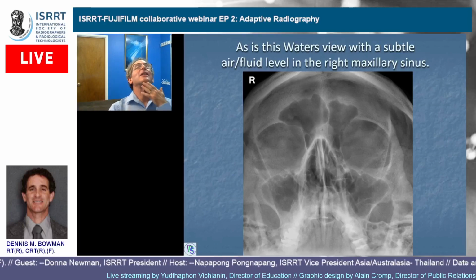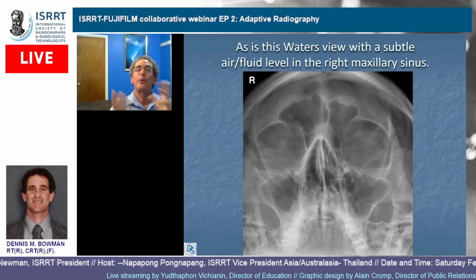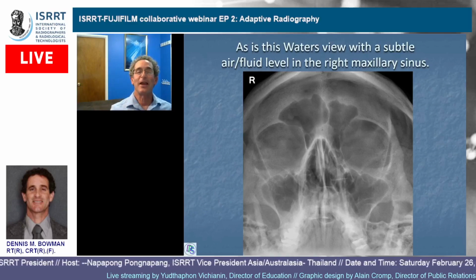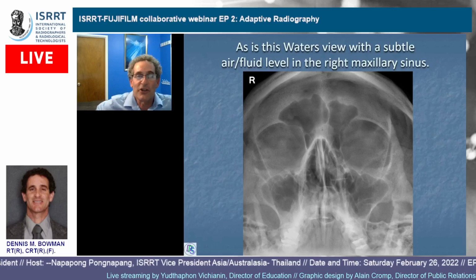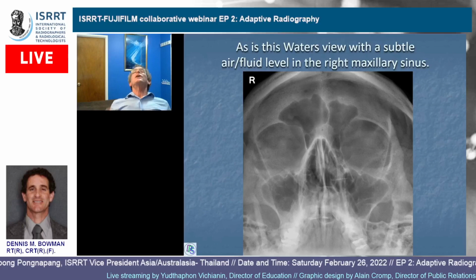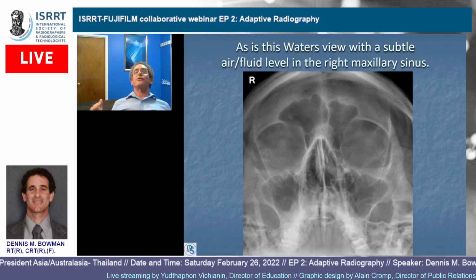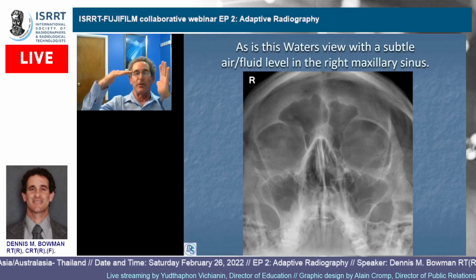So what's the trick? Let's say they really can't lift their chin up, and you don't want to angle your tube. Well, the trick is turn them around AP, and then in the chair, make sure it's a chair that's actually got a back to it, and they can lean back in that chair, and that'll just take their whole body going back. So then they still lift their chin as high as they can, and the rest of it's done with their body, and you can still get the perfect angle.